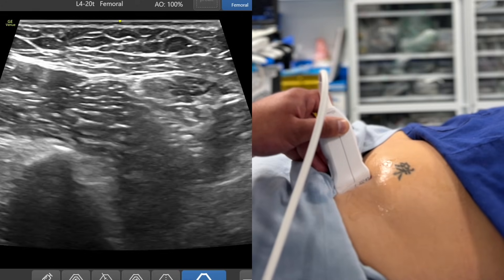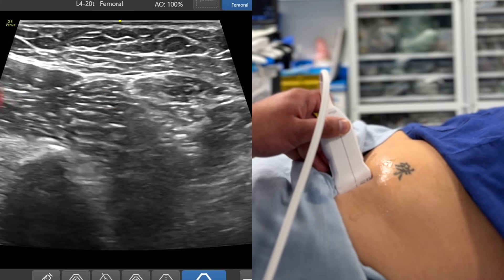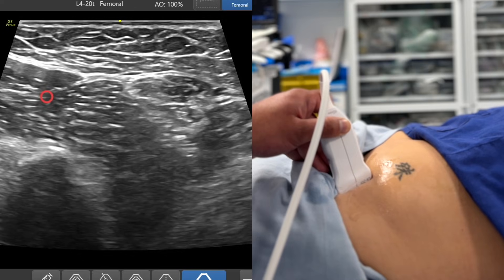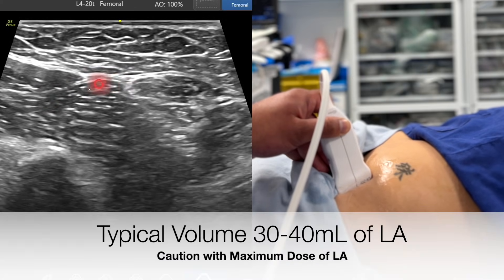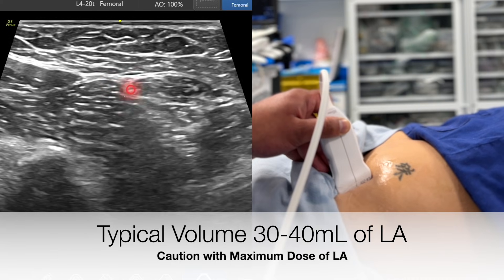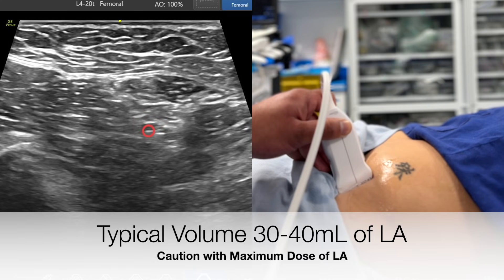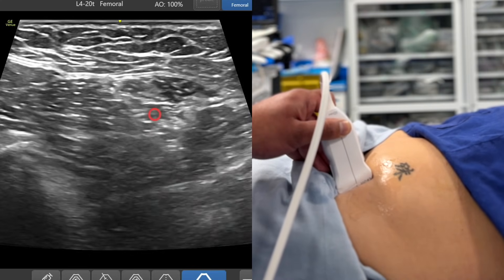Now you can see, if you were going to perform a suprainguinal fascia iliaca block, what you need to do is bring your needle in from the infralateral aspect, pop through the sartorius muscle, inject local anesthetic underneath the fascia iliaca, so local anesthetic dives down towards the pelvic brim, aiming to get the anterior aspect of the lumbar plexus from the anterior aspect.